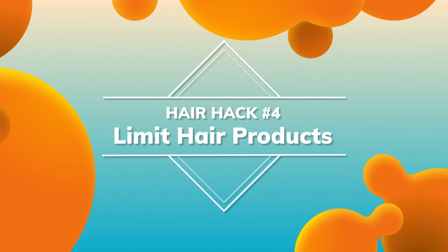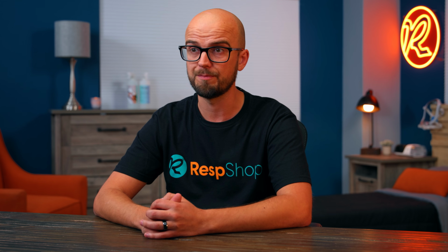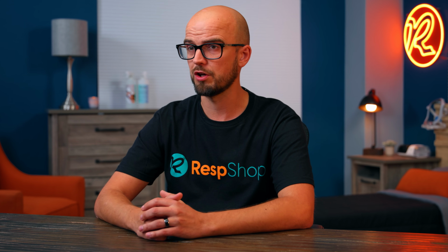Hack 4. If you like to use creams or other hair products, these can make your hair extra slippery for the headgear. You don't need to get rid of all hair products, but try to keep the areas where the straps rest as free from products that make your hair slick as possible, especially if you put them in before you go to bed.